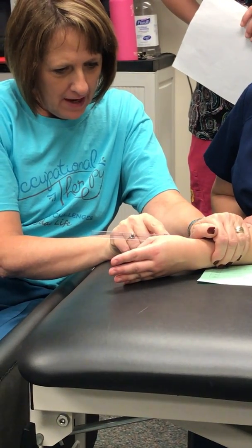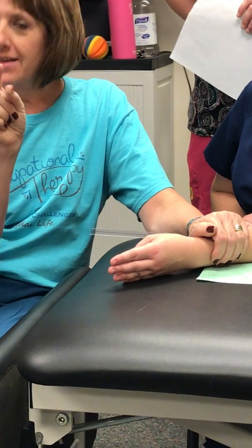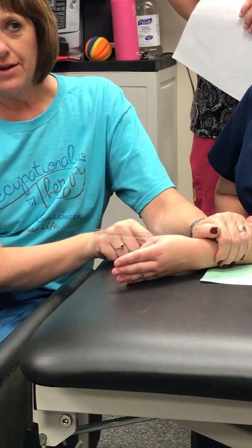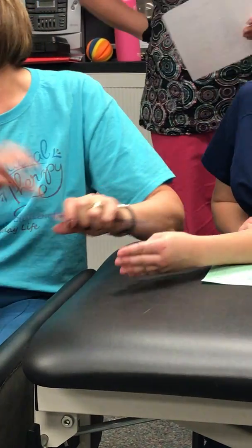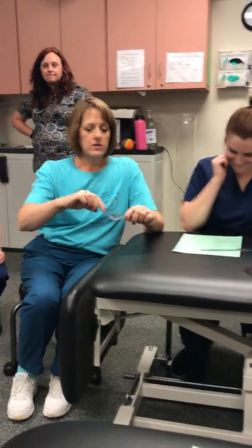Now I'm lined up with the metacarpal and I've gone past zero — I'm at about 5 on the other side, so I add that. I started at 15, went to zero, and added 5, so she has 20 degrees of flexion.